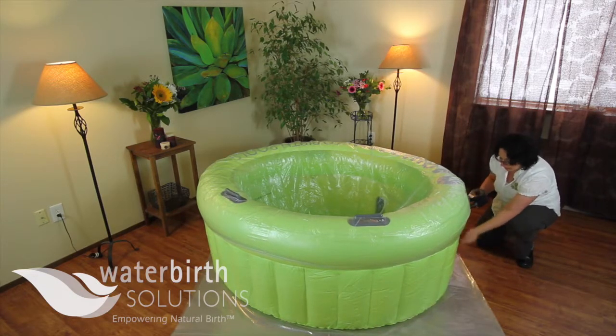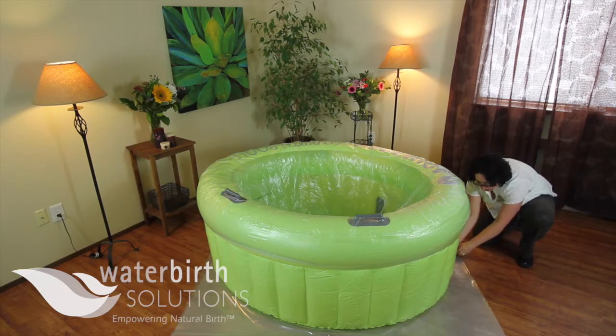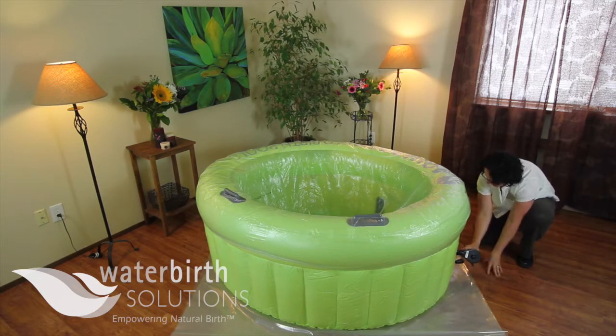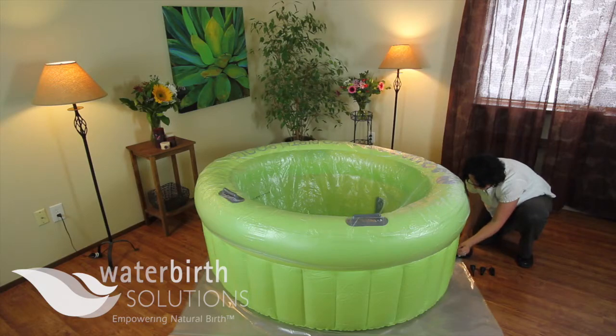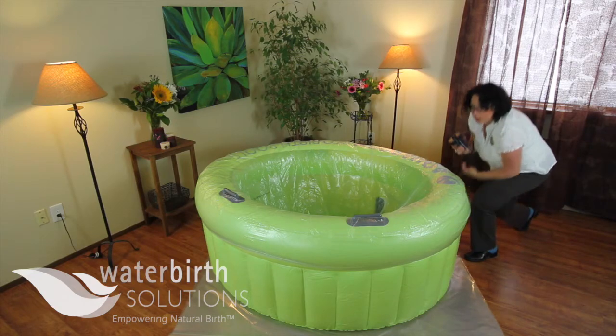Now we're just going to firm up the bottom part and then your pool is ready to be filled. I'm going to leave the bottom portion of the valve tight and just unscrew the top. Tightening this up so there's no air leaking — and here is your completed pool.